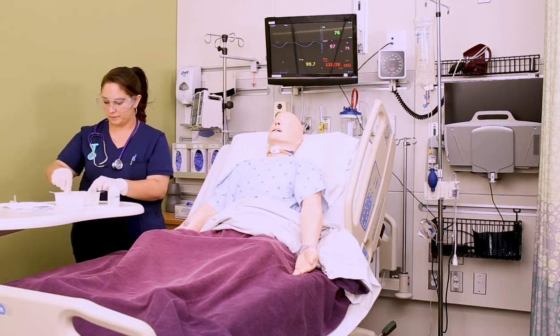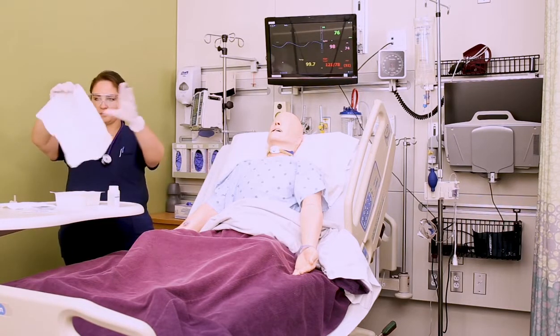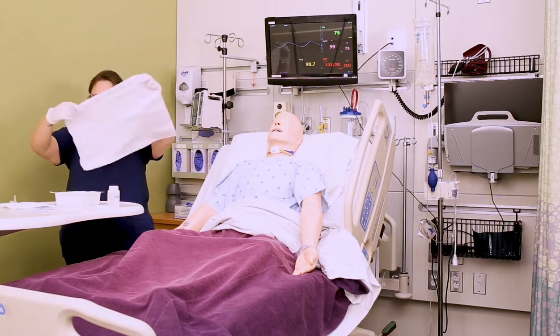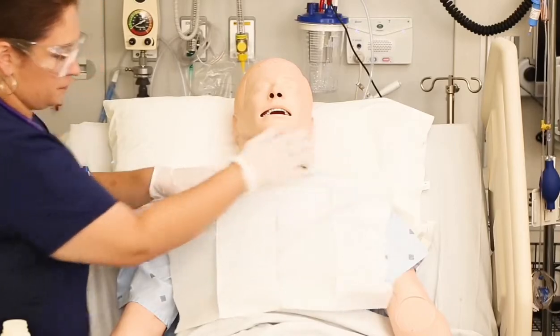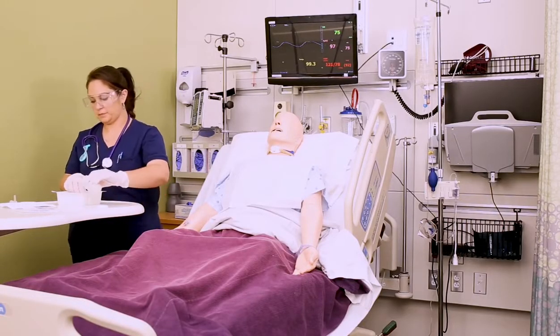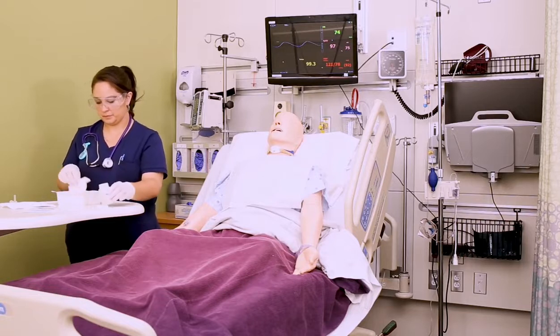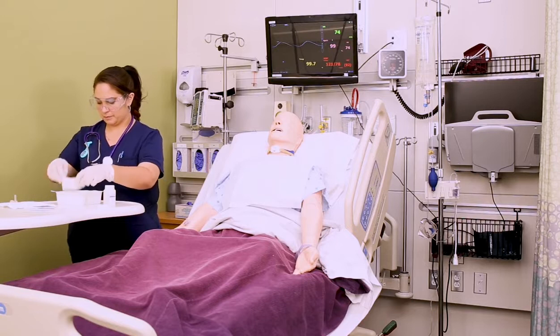So now that you're sterile, you can finish setting up everything inside of your kit. A lot of times there will be a sterile drape that you can use to lay over the patient's chest. Just make sure you keep your hands sterile. If you don't have a drape, you can also lay a towel over their chest before you get started as well. So the first thing we need to do is clean the secretions from the flange of the tracheostomy.